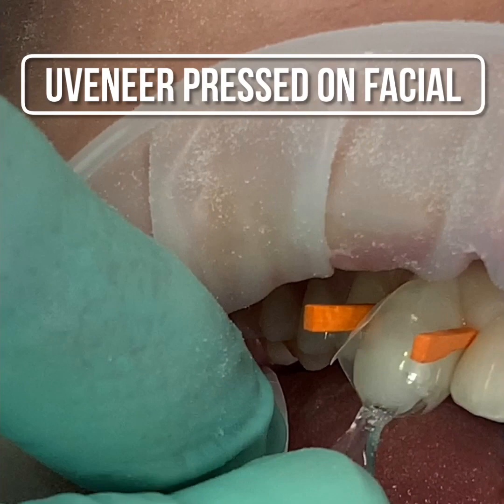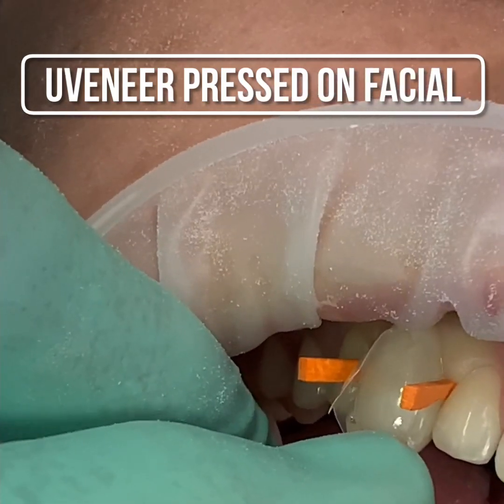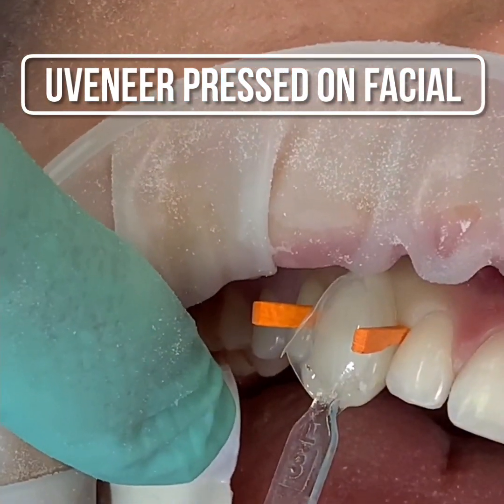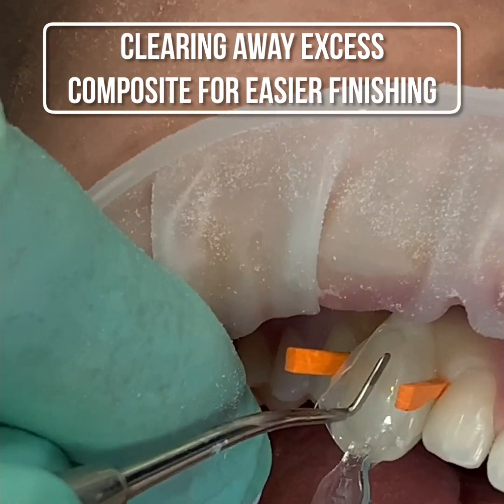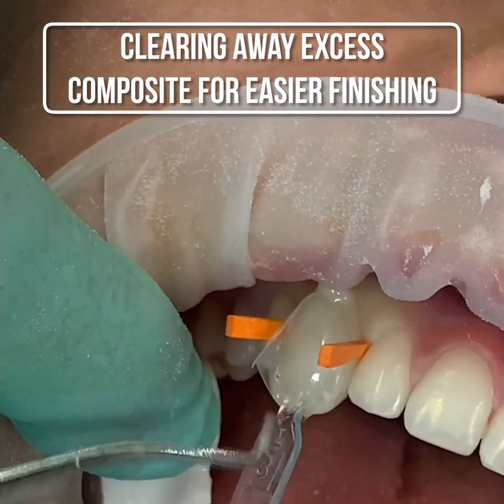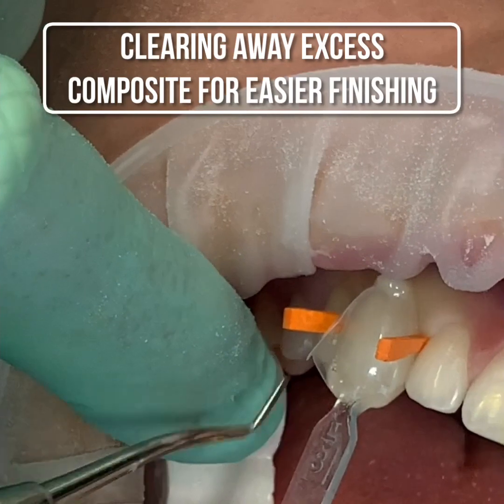When doing this, we'll get some extra material that flows in and around that U-veneer matrix, and so we'll clear it away to save us some extra work at the end of this procedure. So here I am clearing away the excess around the U-veneer on the mesial, the distal, and the gingival, and then also forming the lingual.